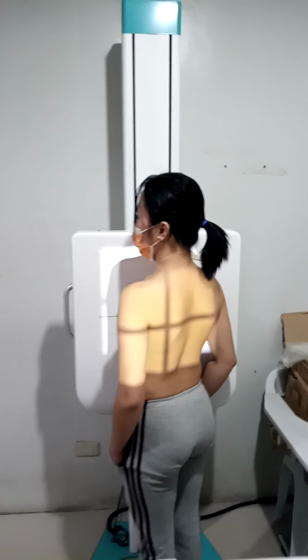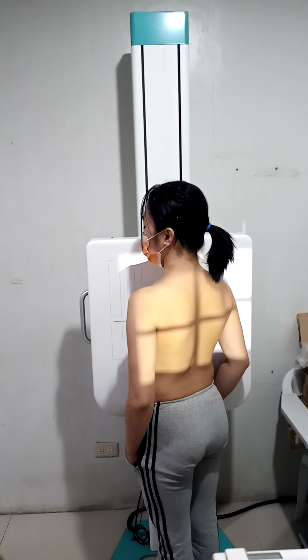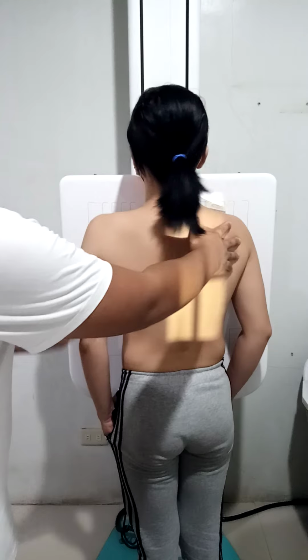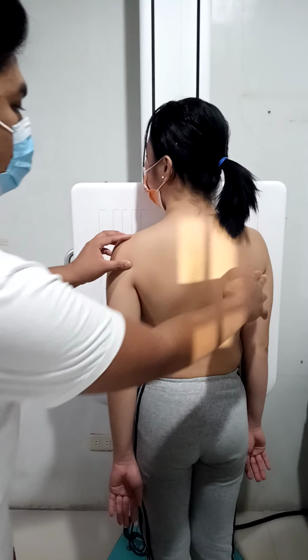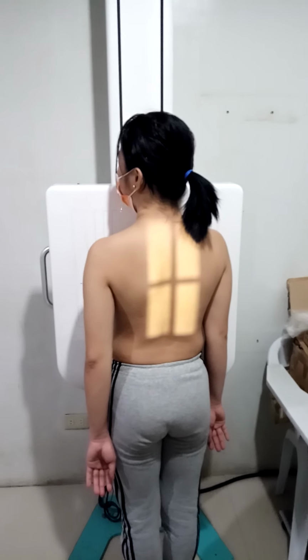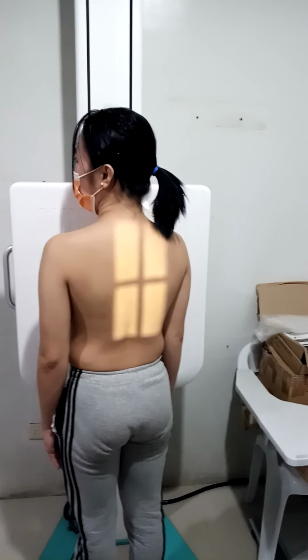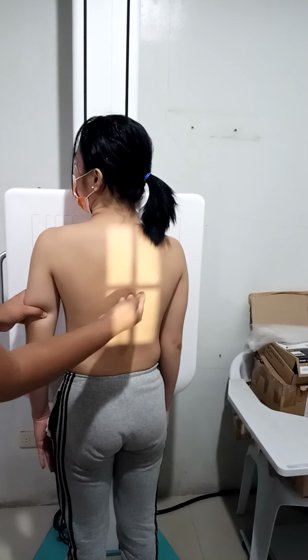So, we need to manipulate this one. Then collimate. Make sure that the patient's sternum is chin up. And make sure that the central ray is perpendicular to the level of thoracic 7, which you can locate at the inferior angle of the patient's scapula.